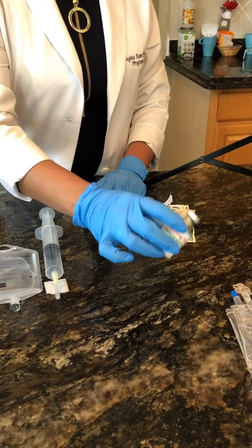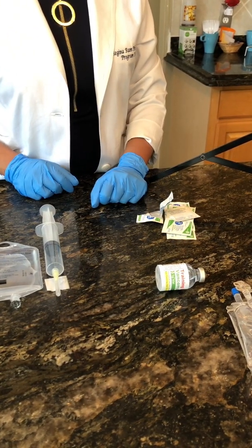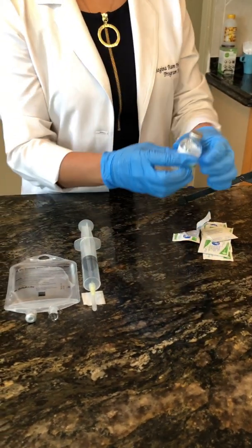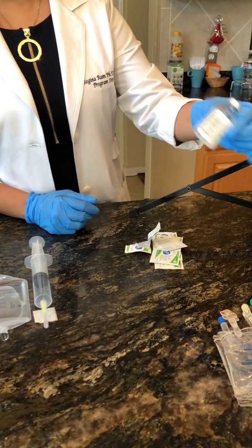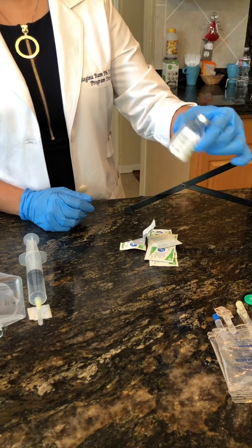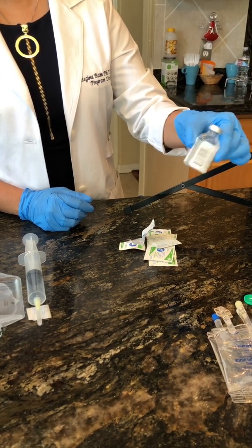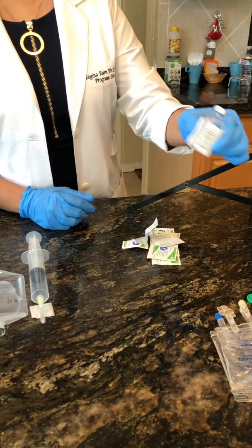Some technicians will lay it on its side — they feel it reconstitutes faster that way. Those are all the methods you can use to assist with reconstitution. Remember, every drug reconstitutes at a different rate, so you'll get to learn your drugs. Some will reconstitute immediately, within 10 or 20 seconds. Others may take 5 to 10 minutes to reconstitute.